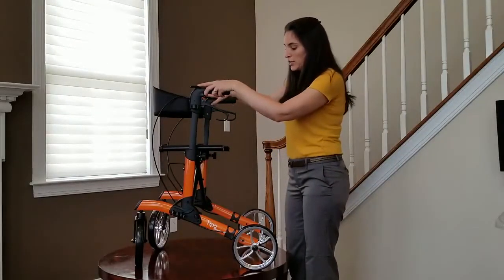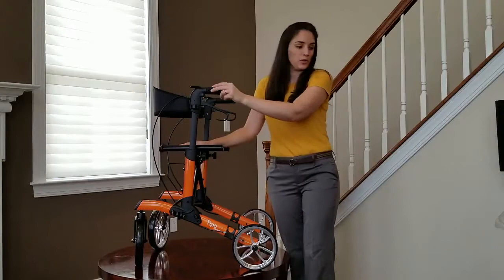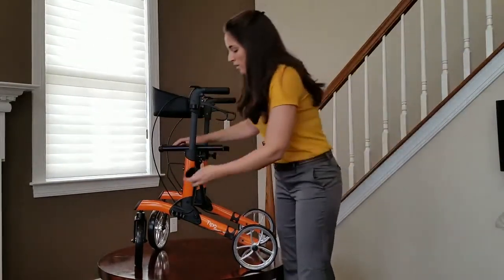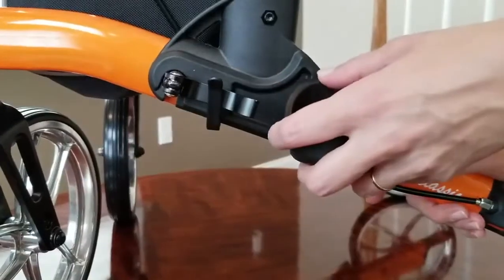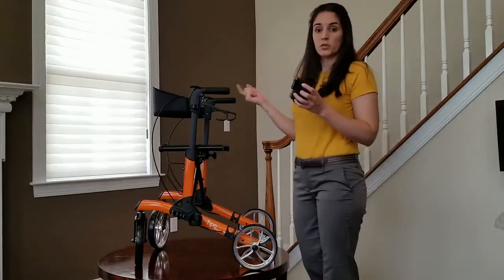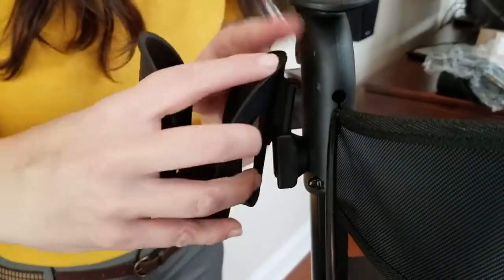Now you're going to install the cane holder. The cane support goes on the left side of your walker and you can simply slide it in. Your Pisa cup holder goes on the right side of the walker, and again, you just gently slide it in.